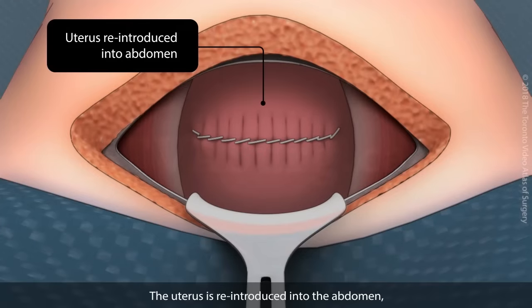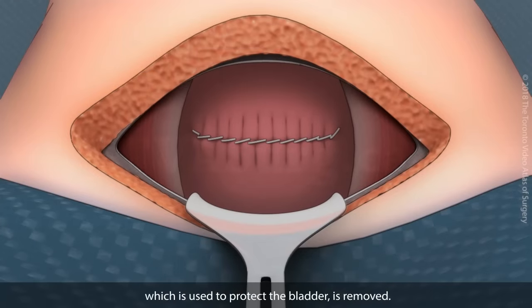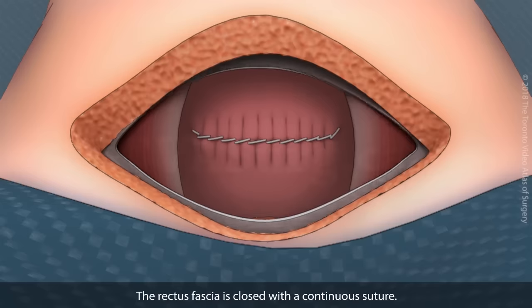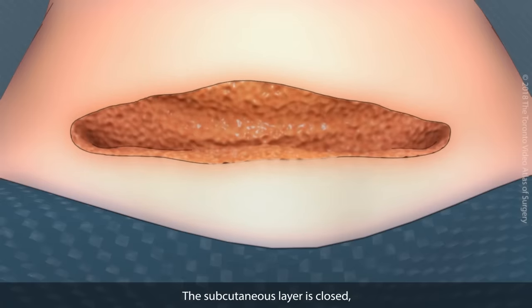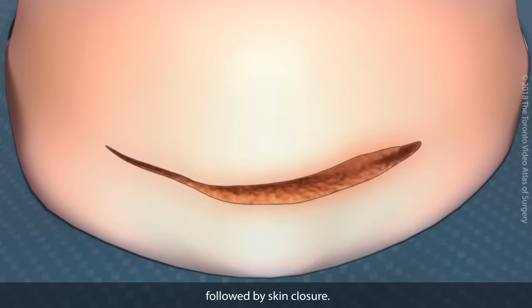The uterus is reintroduced into the abdomen, and the Balfour retractor, which was used to protect the bladder, is removed. The rectus fascia is closed with a continuous suture. The subcutaneous layer is closed, followed by skin closure.